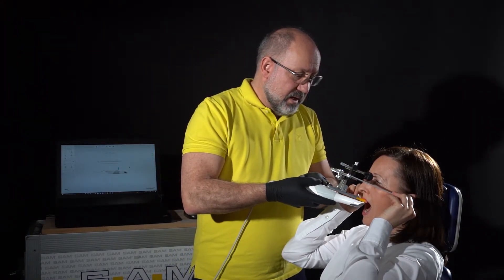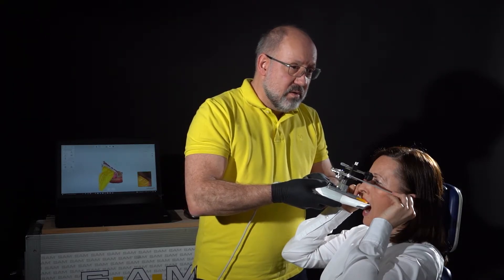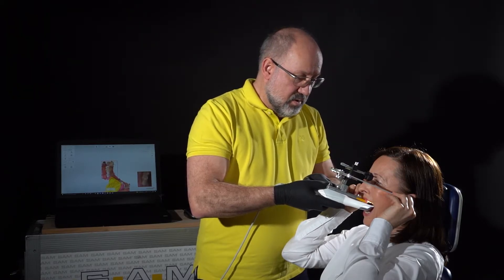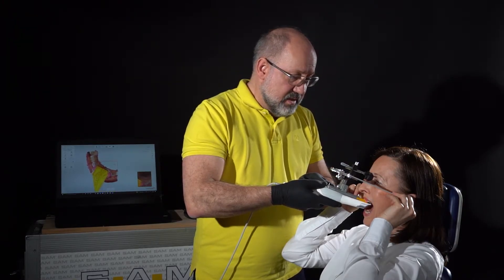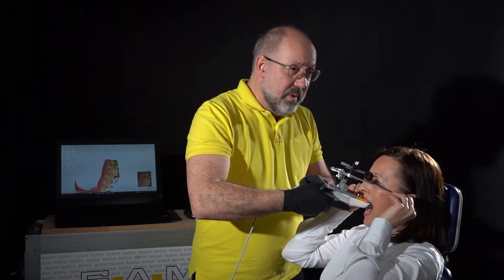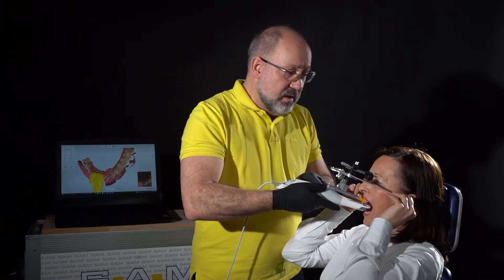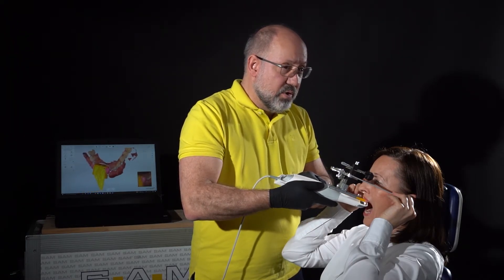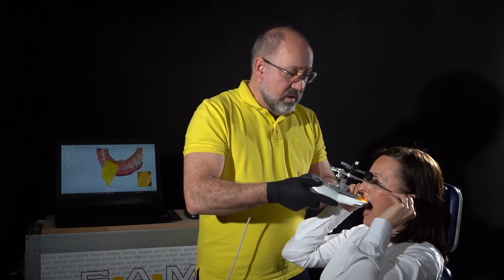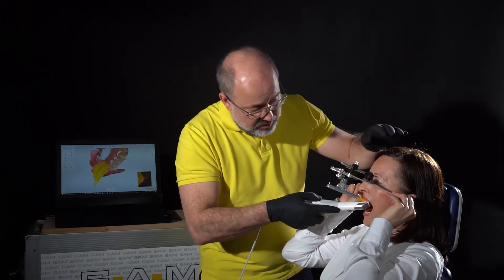I start with my yellow axis check and then I go slowly back and catch the first part of the teeth. The best thing is if I catch the molars — here it is very important that I get a good connection between my teeth and my axis check.